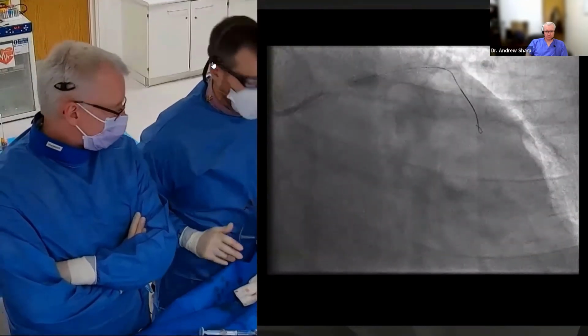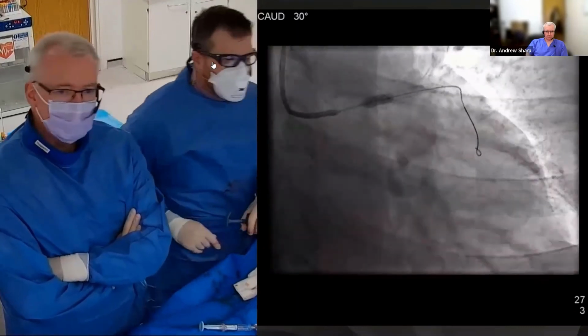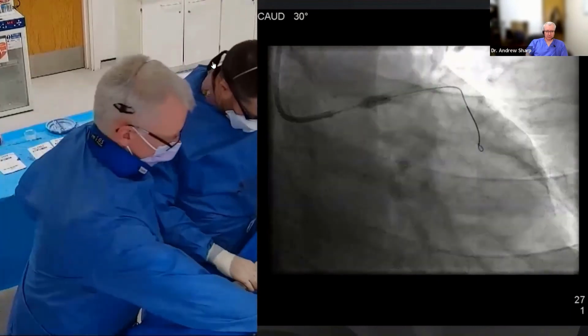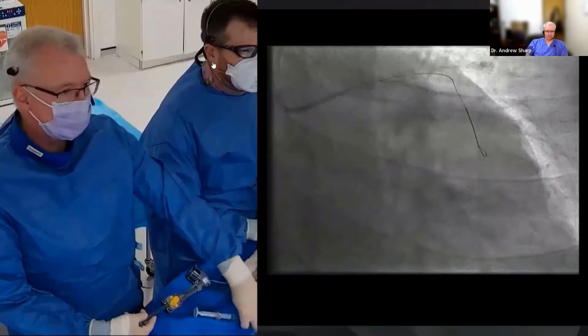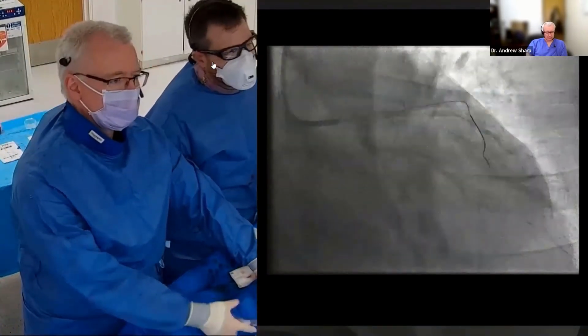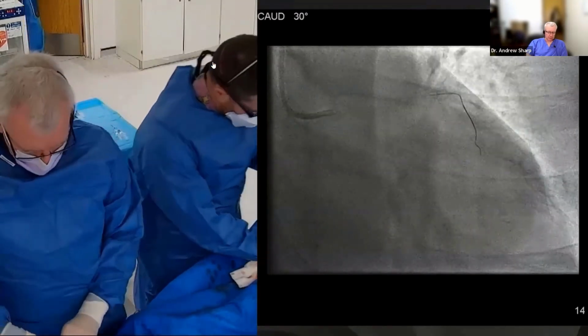We're not going to injure the proximal LAD before the stent. And Sean's going to go to relatively low pressure. I kept it at 10, I think. At 10. So I'm not sure our inflators know how to go only to 10. But in this case, we are going to take quite a low pressure inflation. And then you get the balloon into the catheter and just check you're okay. Just close your O-ring. Let's make sure we're okay. And we're okay. So we'll give you that.